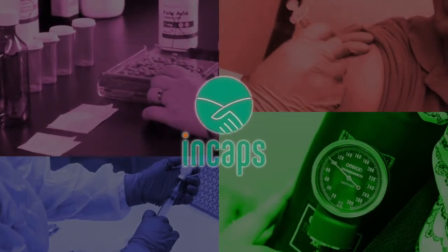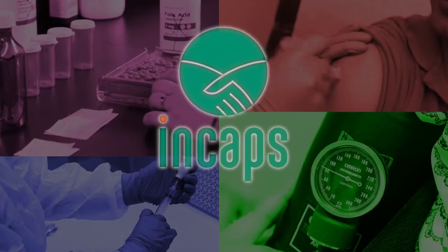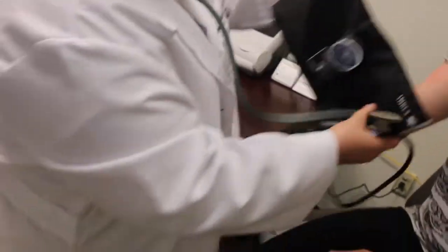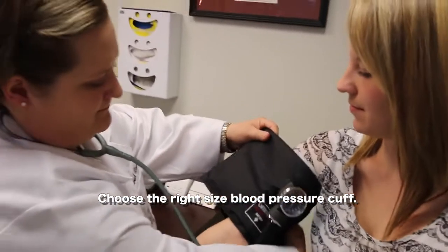In this video we're going to see a patient getting their blood pressure measured. The first step in measuring blood pressure is selecting the appropriate cuff size, because if we have the wrong cuff size we won't get an accurate reading.